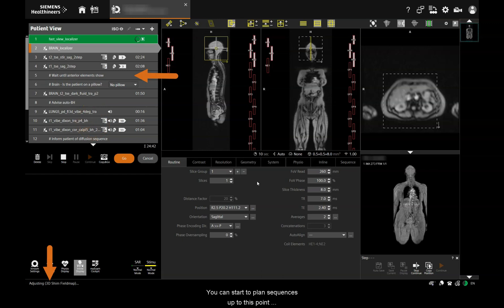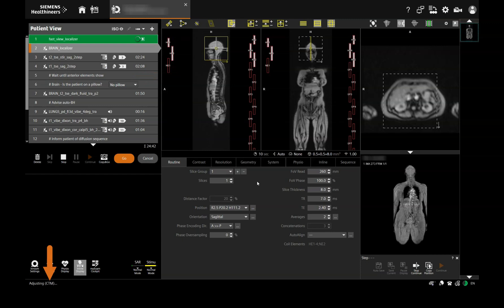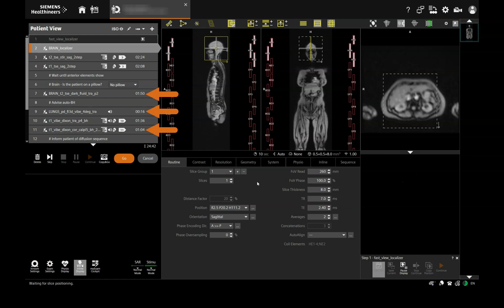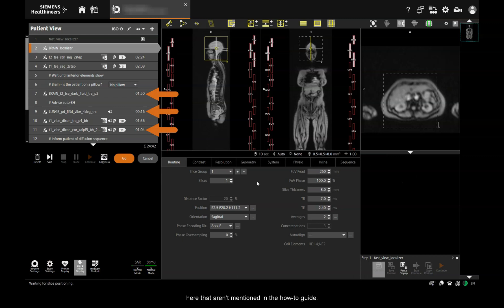You can start to plan sequences up to this point, but for the purposes of this demonstration I'm just going to wait until the adjustments are complete. This takes a while, so I've sped it up so we can move on. This is a comprehensive whole body MRI, so you'll see steps here that aren't mentioned in the how-to guide — you can skip these if they aren't required as part of your protocol.